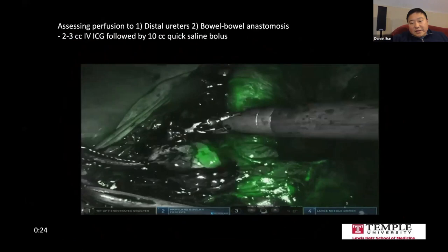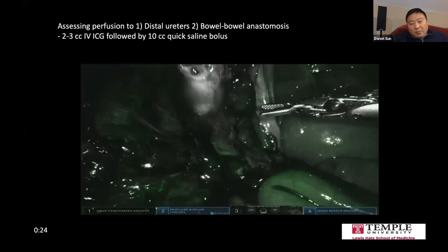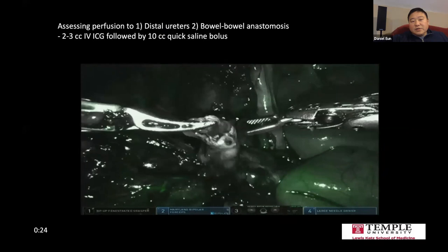And so here the ureters have been disconnected. You can see this is a left ureter on the spatulation, just on the left side that needs to be trimmed a little bit. You could see that it's a little bit cold. But look at this, under white light, it looked completely normal, the right ureter. But you can see a good 4 or 5 centimeters of distal ureter is completely devitalized without any blood supply.